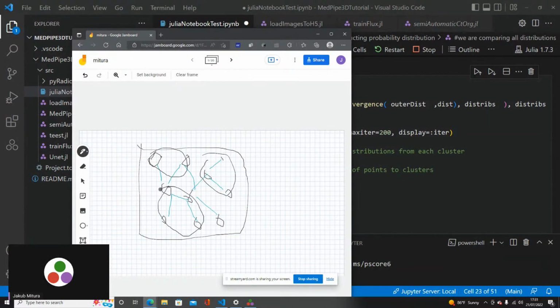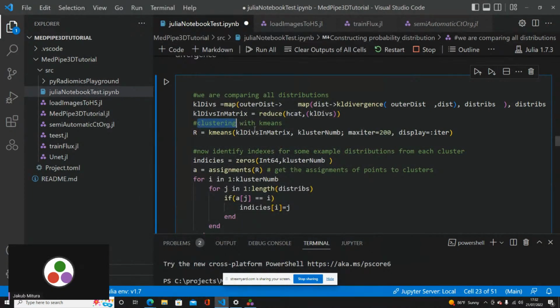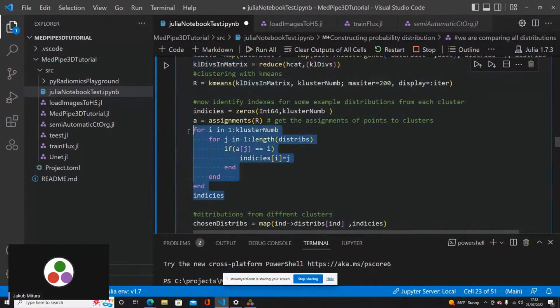Next, I choose a single probability distribution from each cluster to represent it. The idea is that if a lot of Gaussian distributions are similar, they hold the same data and are redundant. So I get rid of this redundancy by keeping only those Gaussian distributions that are the most important for the task at hand, so they are the most different from each other.